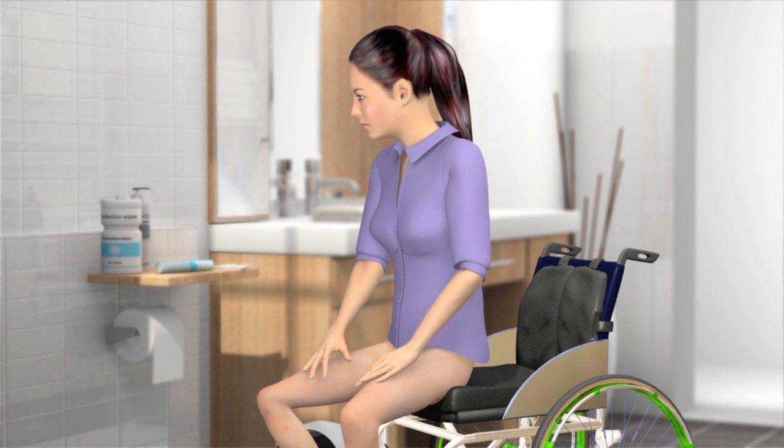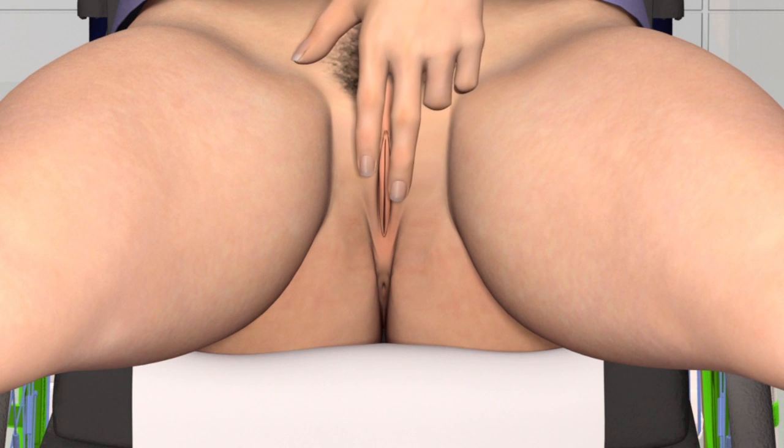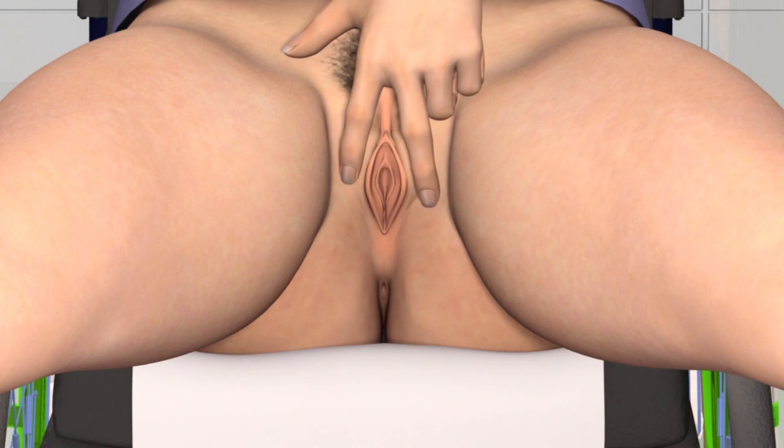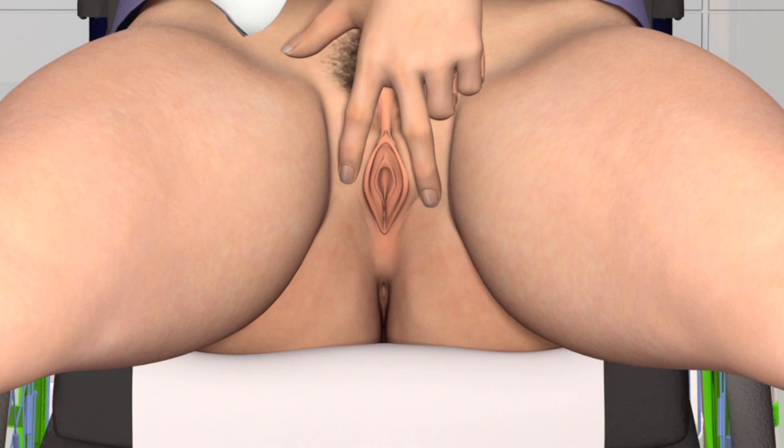To prevent pushing bacteria into the urethra and bladder when you use the catheter, you must first clean the area around the urethra properly. This might be easier if you fasten a mirror onto your thigh. Spread the labia apart and wash the opening to the urethra, washing from front to back in order not to transfer any bacteria and cause an infection. Use each wipe only once.